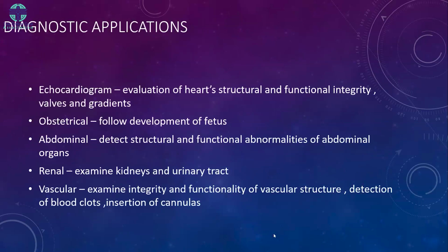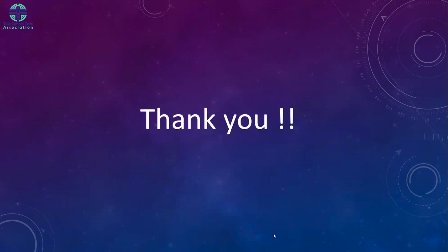In the renal system, it examines the kidney and urinary tract, and it can be used post-transplant, wherein you can visualize the vascularity of the newly transplanted kidney. And it can also be used to examine the vascular structures, to assess their integrity and functionality, detect blood clots, as well as for insertion of cannulas, which is most commonly done in the ICUs.